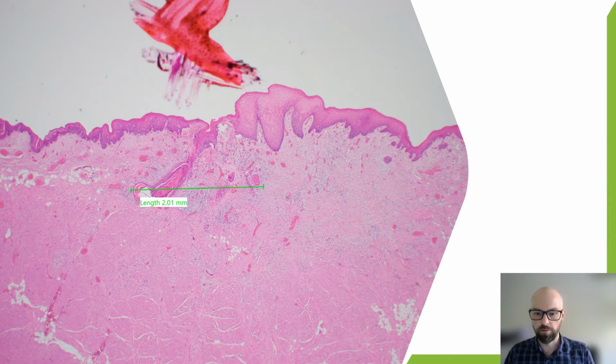And so the way in which I measure microscopically is I've got a camera attached to my microscope, and I've got a calibrated digital ruler which I use, and it really makes the measurement quite easy. I do the same with depth of invasion, and also if there's any close margins, I use the camera with a calibrated ruler to make a measurement. If you don't have that, you can get a transparent ruler of acetate paper, which can just be overlaid on the slide, and then you can look down the microscope and get a clear measurement there.